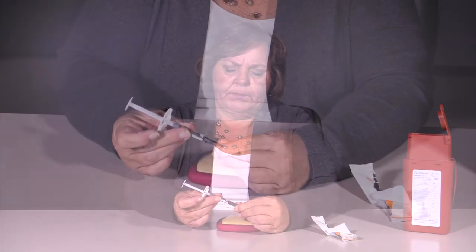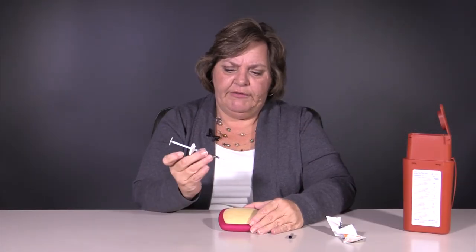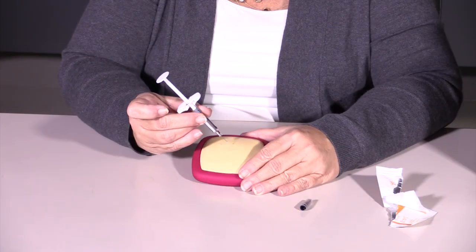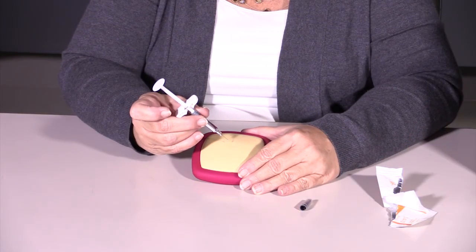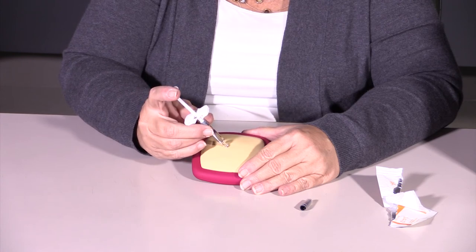The next thing you're going to do is take your syringe and remove the cap. This is not a big needle, but it is very fine and very sharp, and you want to hold it like a dart. You want to firmly but quickly enter the skin. Once you've entered the skin, you depress the plunger. And now your medication is done.